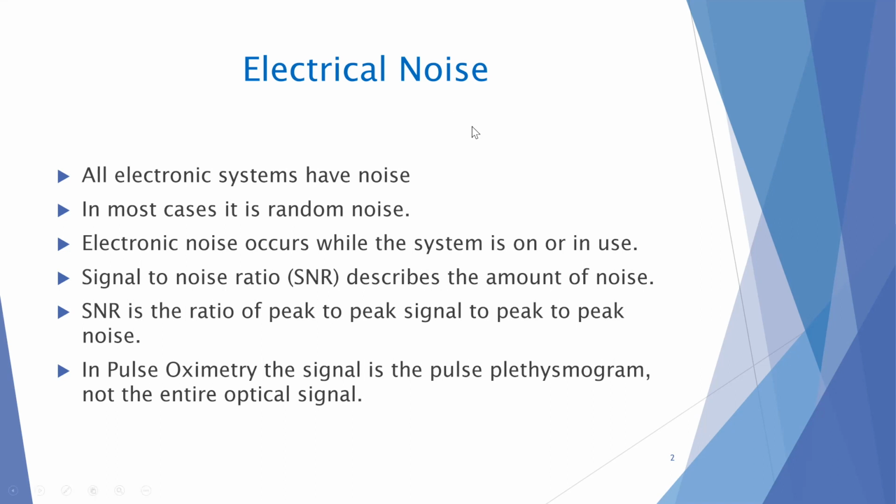And so when the extremity is heated, you're also looking at erythema. I mean, that's just part of the scale when you're able to get these optical measurements. Are you seeing differences that potentially could affect that bias when that extremity is heated versus not?